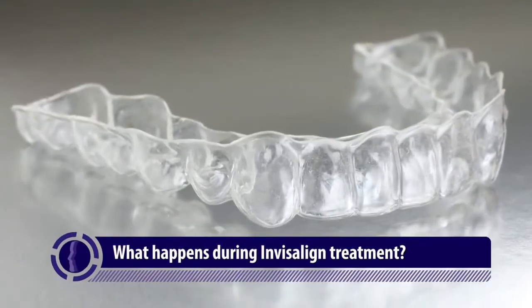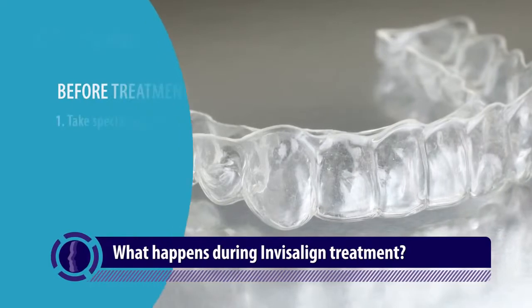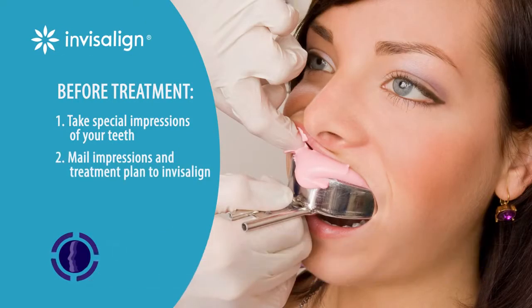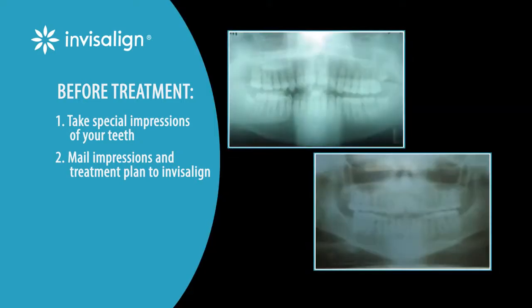So if you come in and we determine you are a candidate for Invisalign, what we do is take special impressions of your teeth. We mail those impressions to Invisalign, and based on the treatment plan that I came up with from our clinical exam, and from the photos and x-rays, I will sit down and type up a detailed treatment plan of exactly how I want your teeth to move.